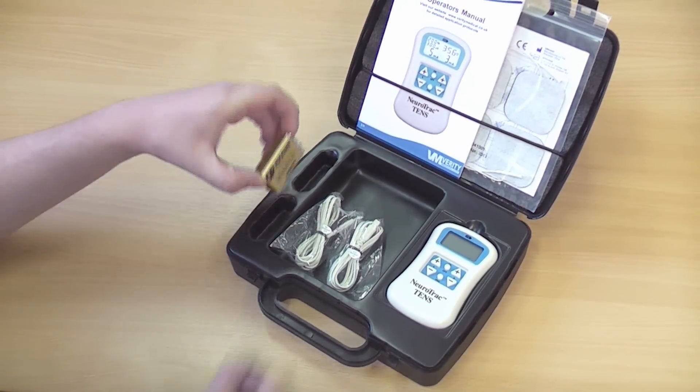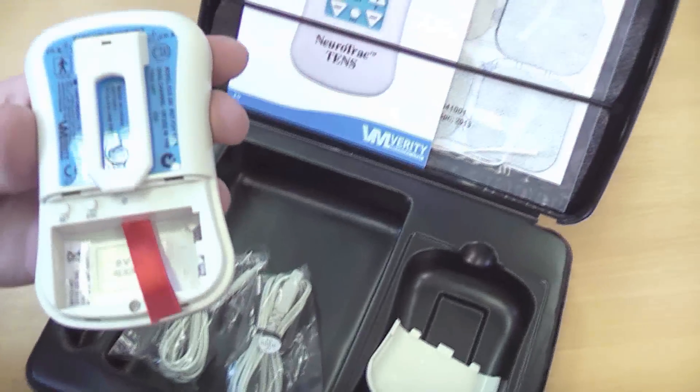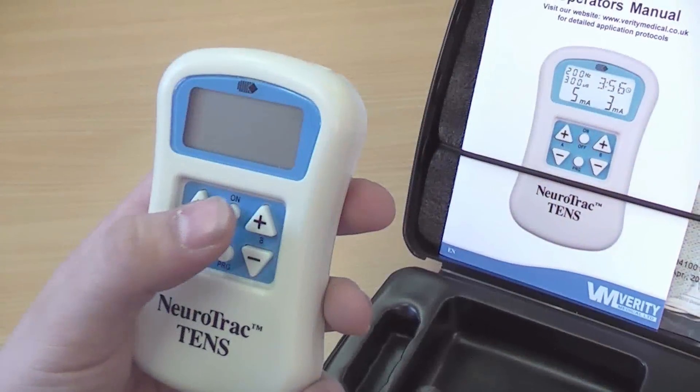To start, remove the protective strip from the contacts on the battery and insert the battery following the clear polarity guide inside the unit. Check to see it turns on OK.